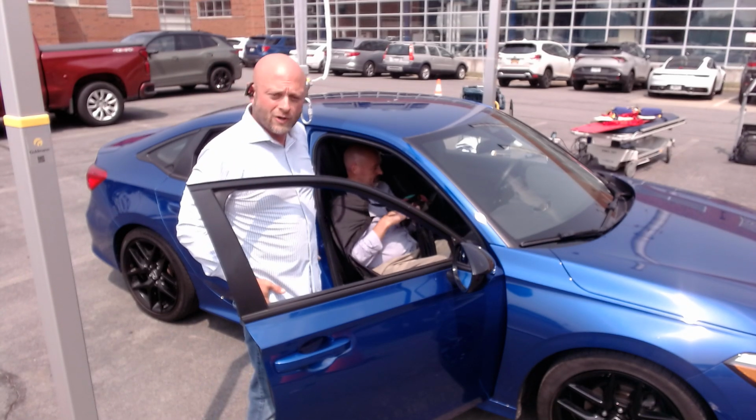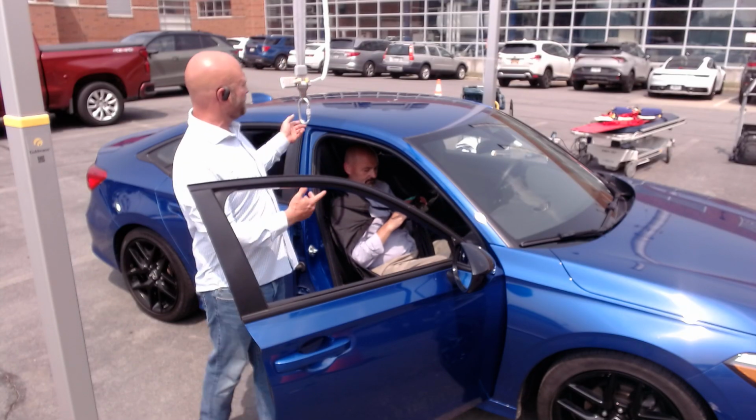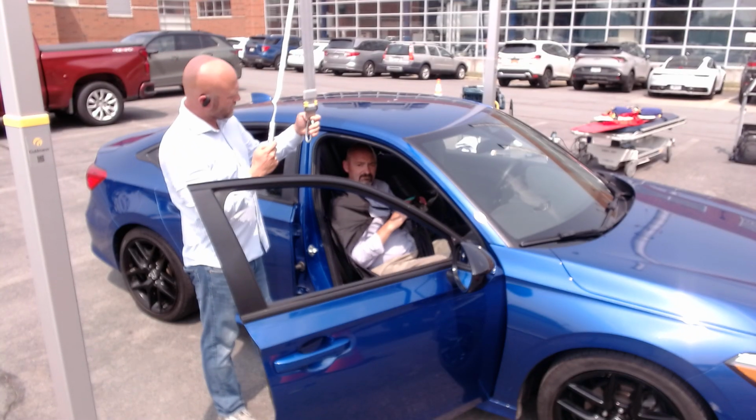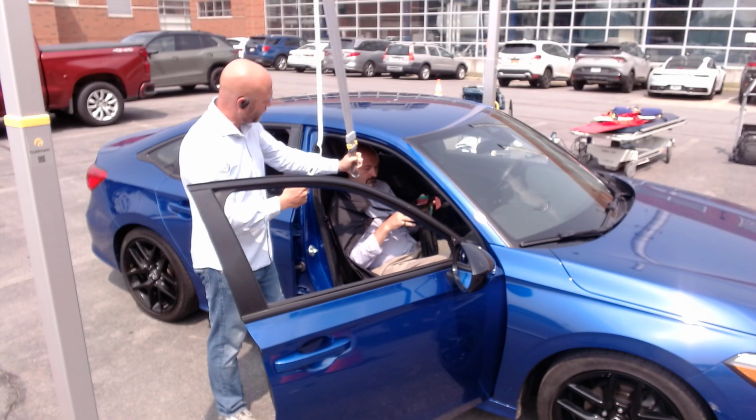And also use a shorter strap on his legs to activate his hips first to get that weight off of his body. So at this point, I'm just going to lower the sling arm, or carabiner in this case. All of the loops are going to go to the same point.